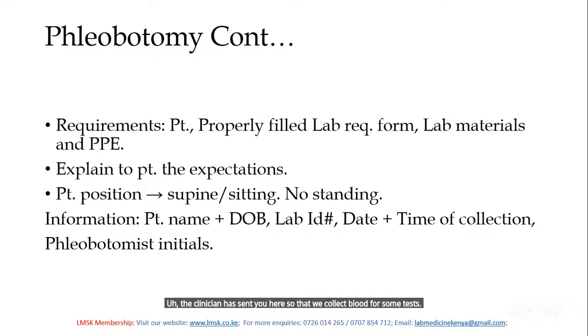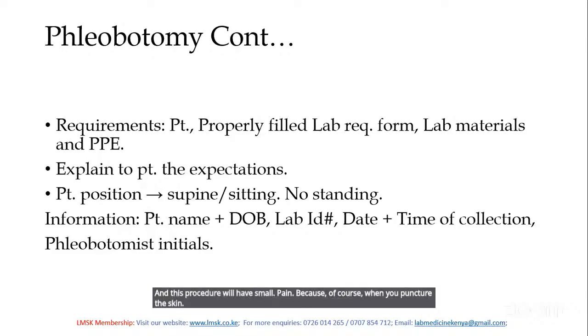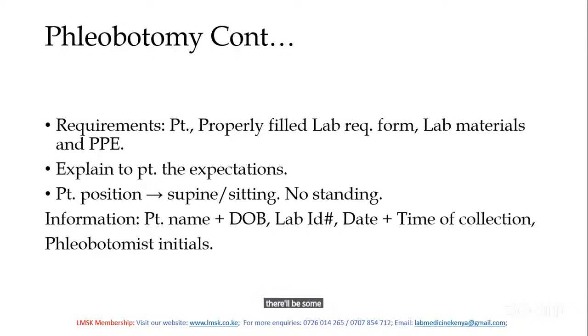And you can go ahead and prepare the patient by telling the patient that we are going to get the blood from the vein, and this procedure will have small pain, because of course, when you puncture the skin, there will be some minor pain. Just prepare the patient, some minor, bearable pain.